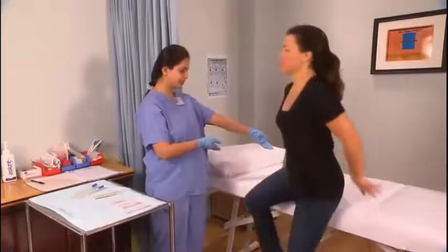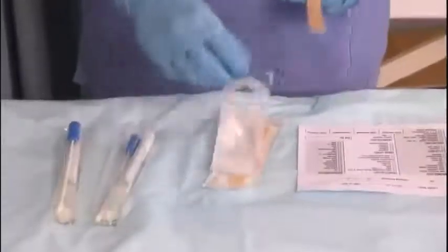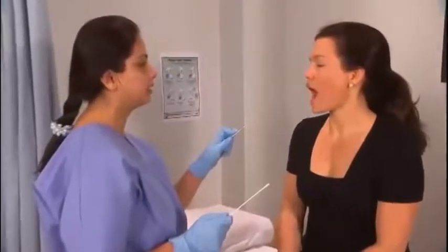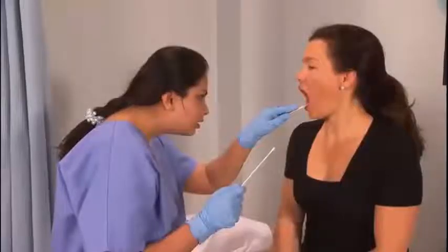Position the patient for the procedure. Open the sterile swab packaging carefully. Pick up the tongue depressor and the sterile swab. Ask the patient to open their mouth and say, "Ah." Place the tongue depressor on the tongue and depress.